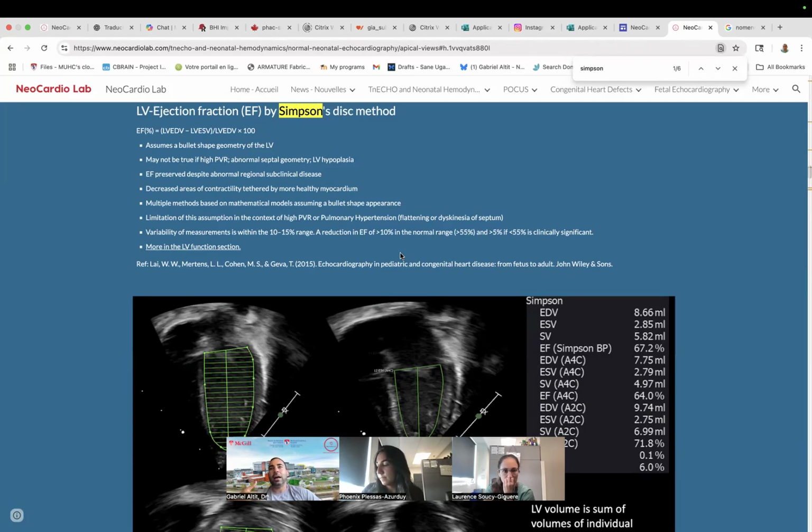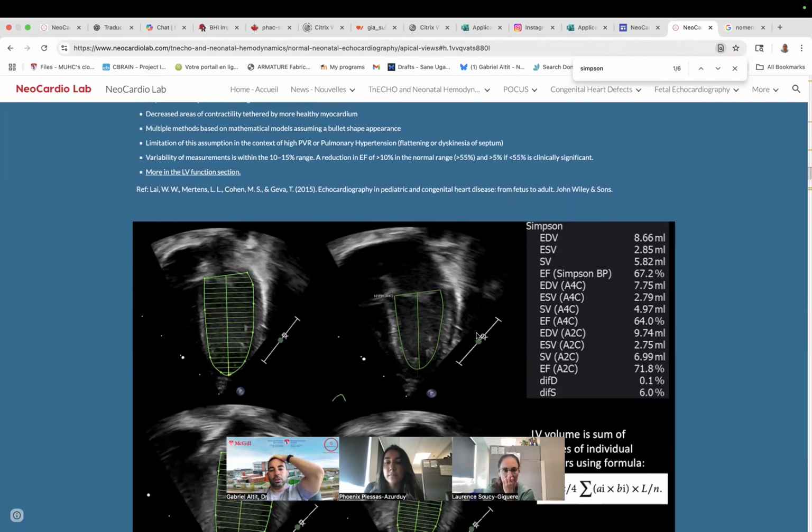They may have NEC, or intestinal intolerance. So sometimes we go a bit quicker in the subcostal for these tiny prems because they tolerate the pressure on their belly less. If we're able to describe the methodology well, I prefer that we stay consistent and stay on the short axis. But it's true that it was originally described from the subcostal, so I want you to be aware that the technique has been described that way, and this is a bit of a variation from the original technique.